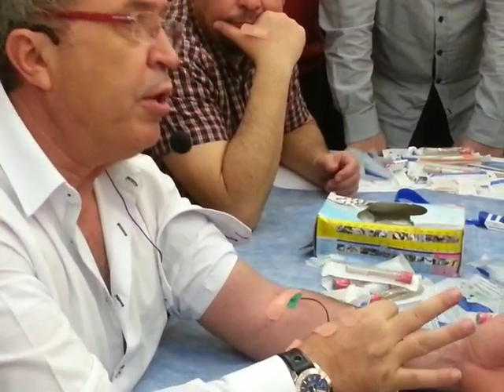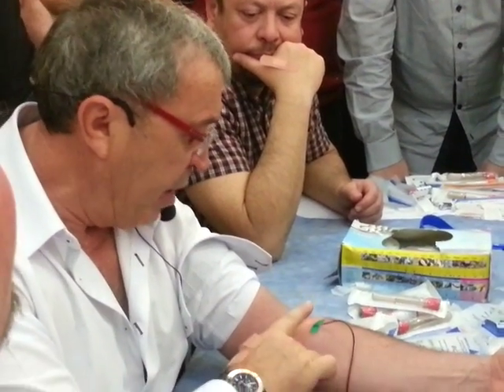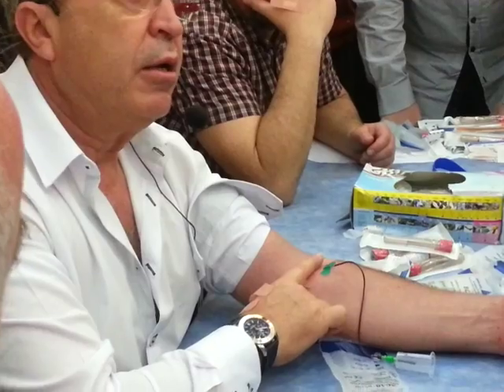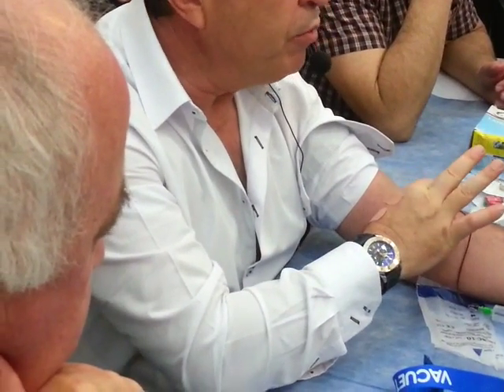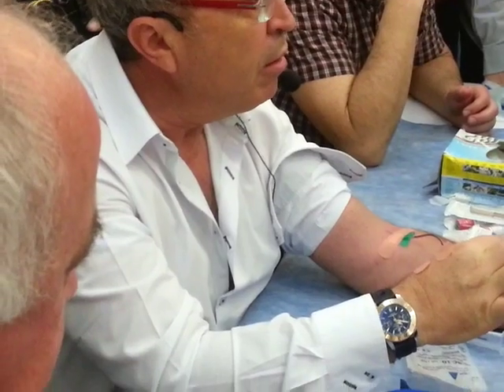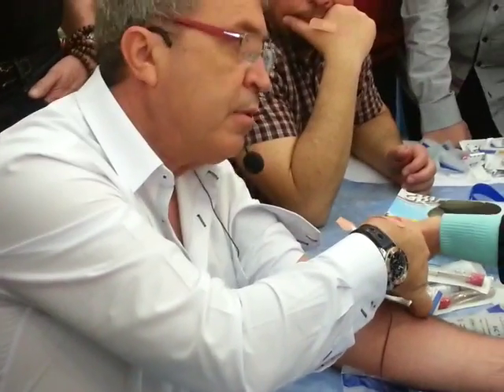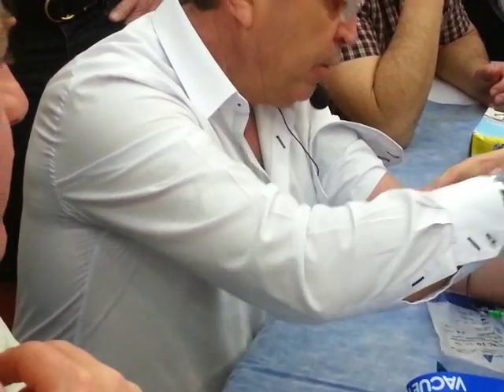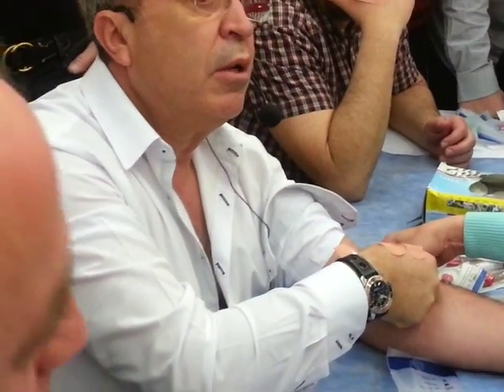If I remove the needle, I have to close the pen. But if I press the skin, it's painful. What I have to do is to remove the needle fast and then prepare your finger to press. You prepare your finger to press and then you take this one and you finish — press. You already have the sticker and then it's finished.